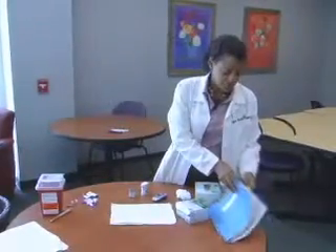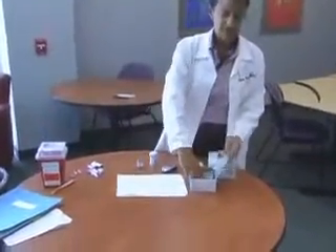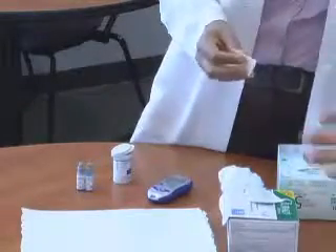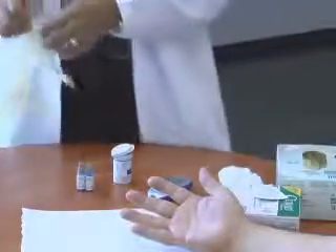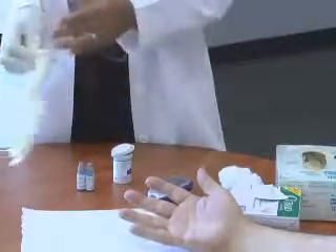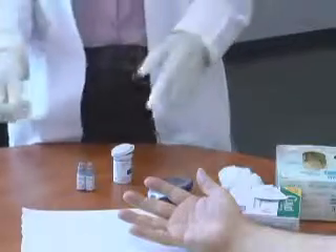Then, the next thing you want to do is have them sit down, and I will take an alcohol swab and swab their finger. Go ahead and swab the finger well, then let it air dry. You never want to prick a finger that's wet with alcohol because it will sting. Then you place on your gloves — you'll probably want to use two gloves. If you have a ring on, you may want to turn the stone inside to make it easier to get gloves on and off, or if you're doing a big screening, leave your wedding ring at home so you don't accidentally pull it off inside the glove.